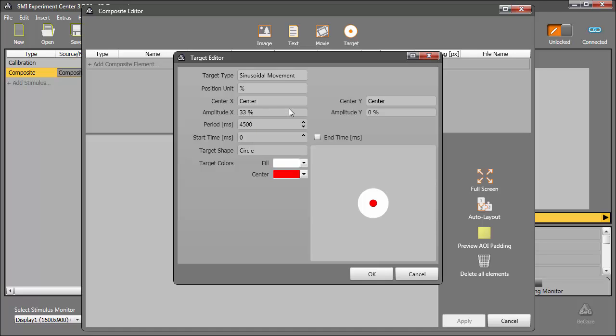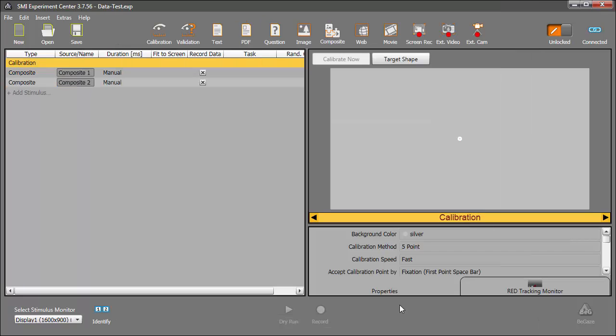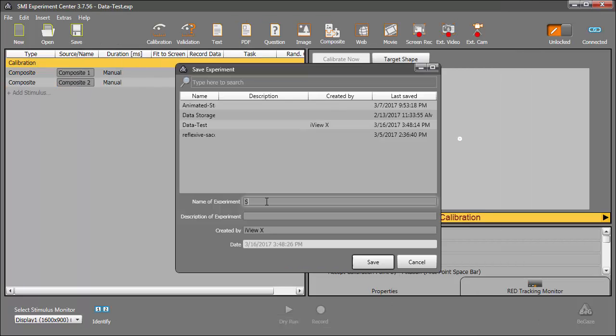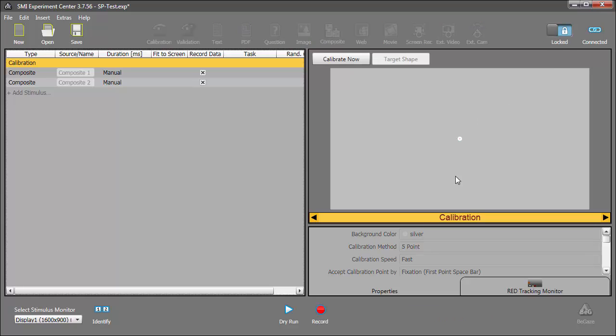Once we click OK in the target editor, we can name this composite stimulus. I'll call this SP, short for Smooth Pursuit, sinusoidal, and change the width to 6%. I'm ready to apply the stimulus. Again, we save the experiment. I'll name it SP Test. Now I'll lock it and give it a dry run.